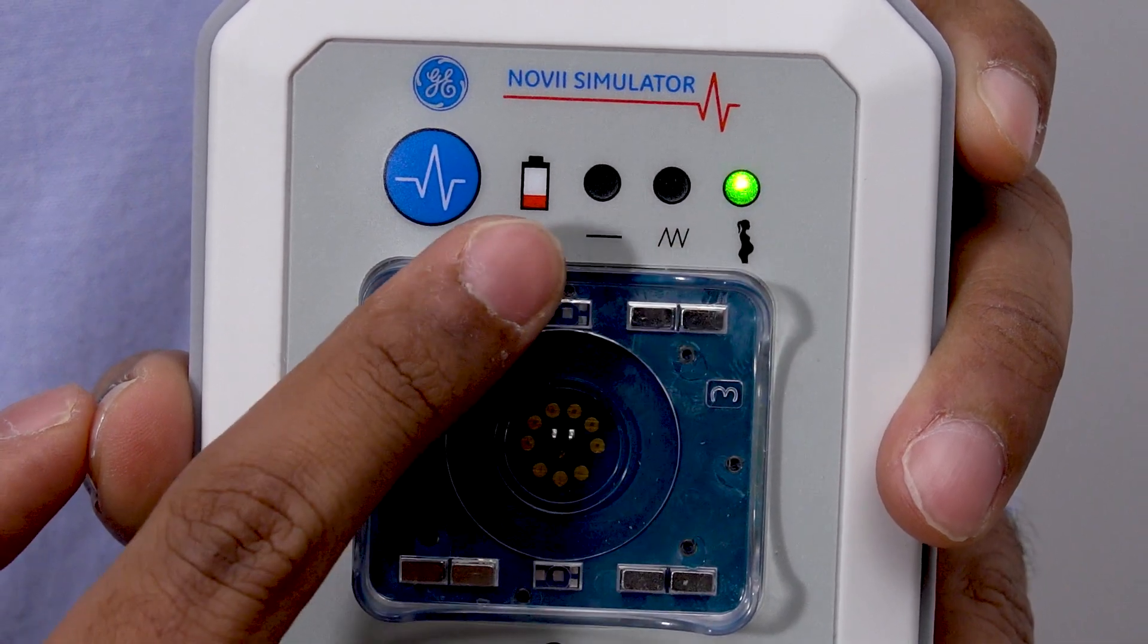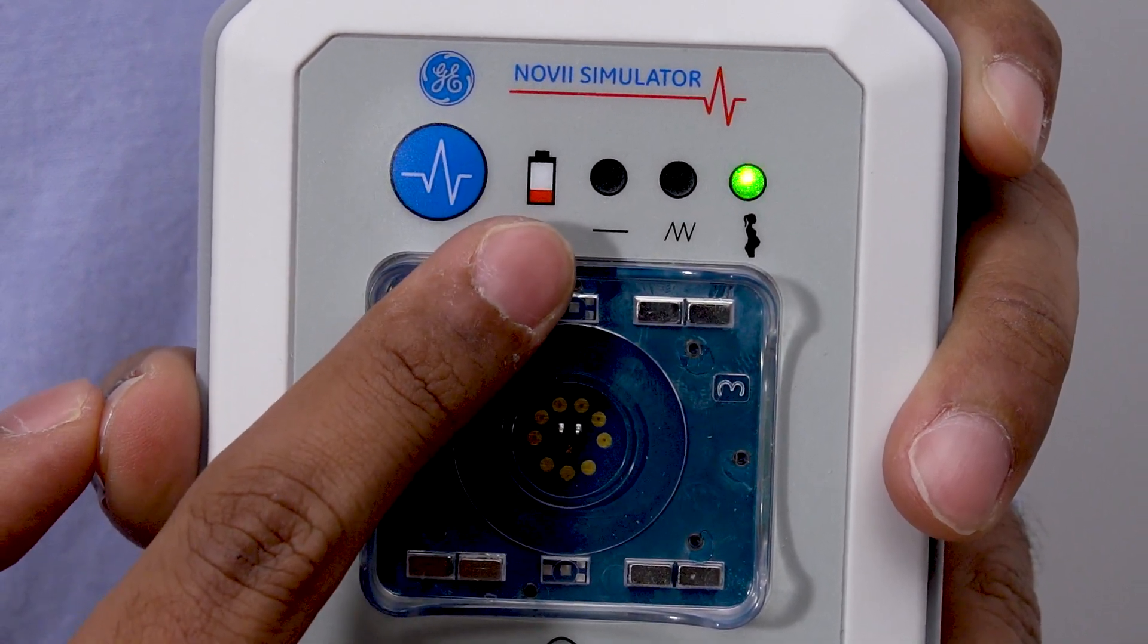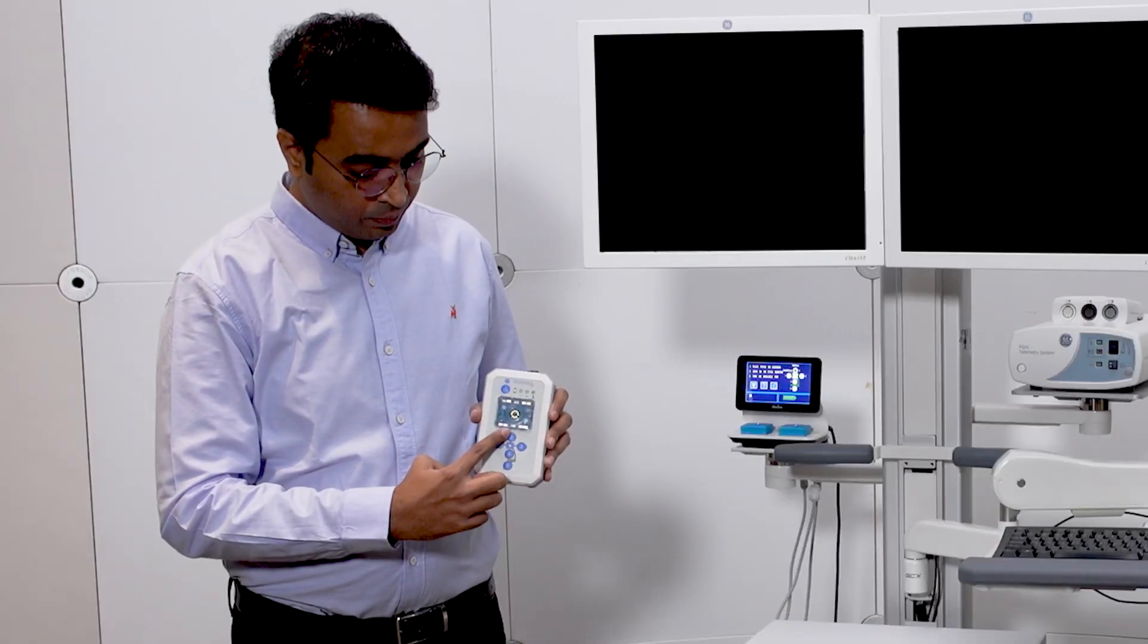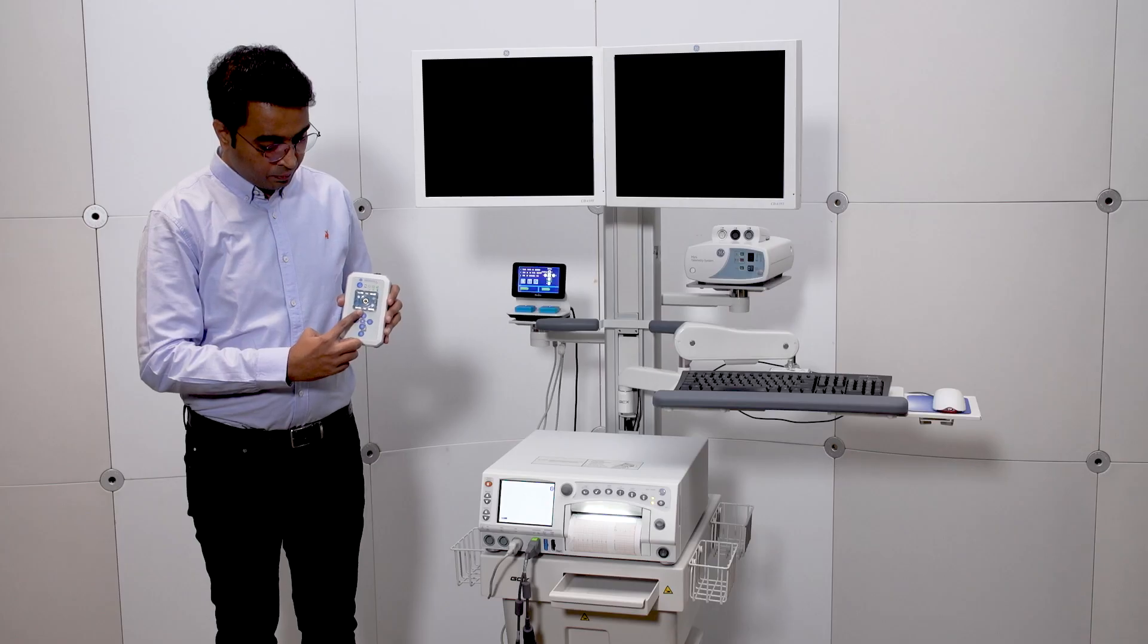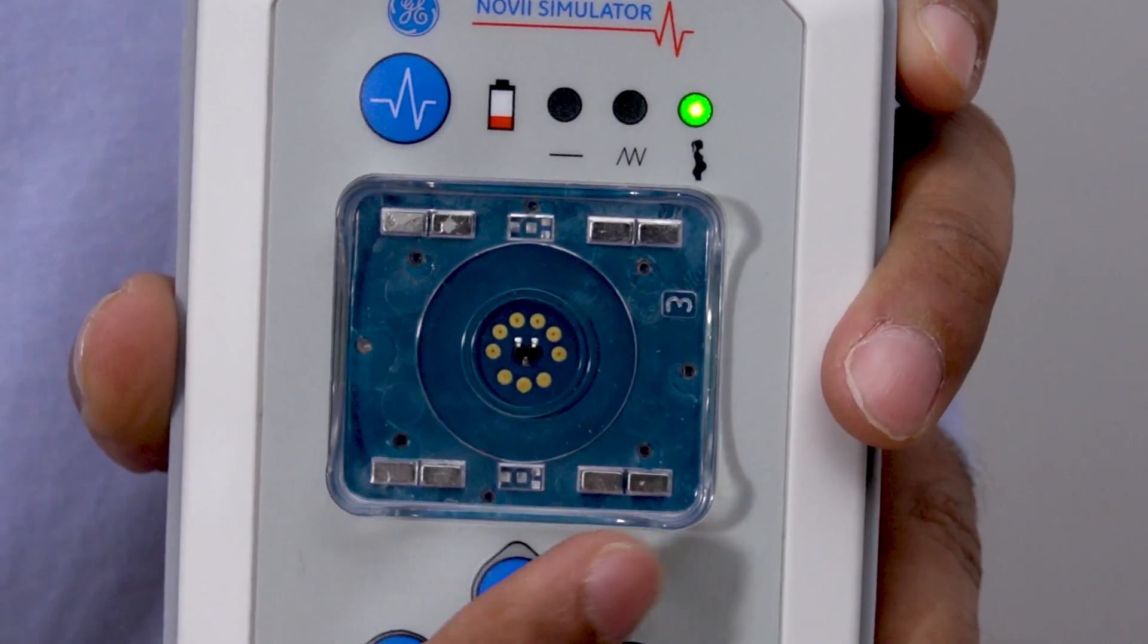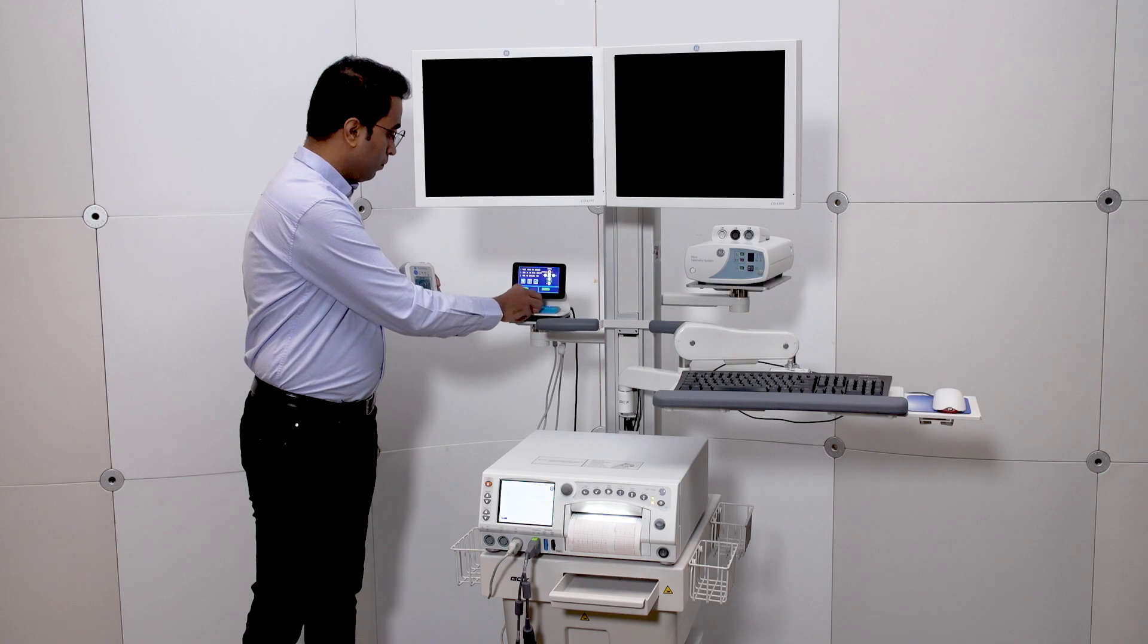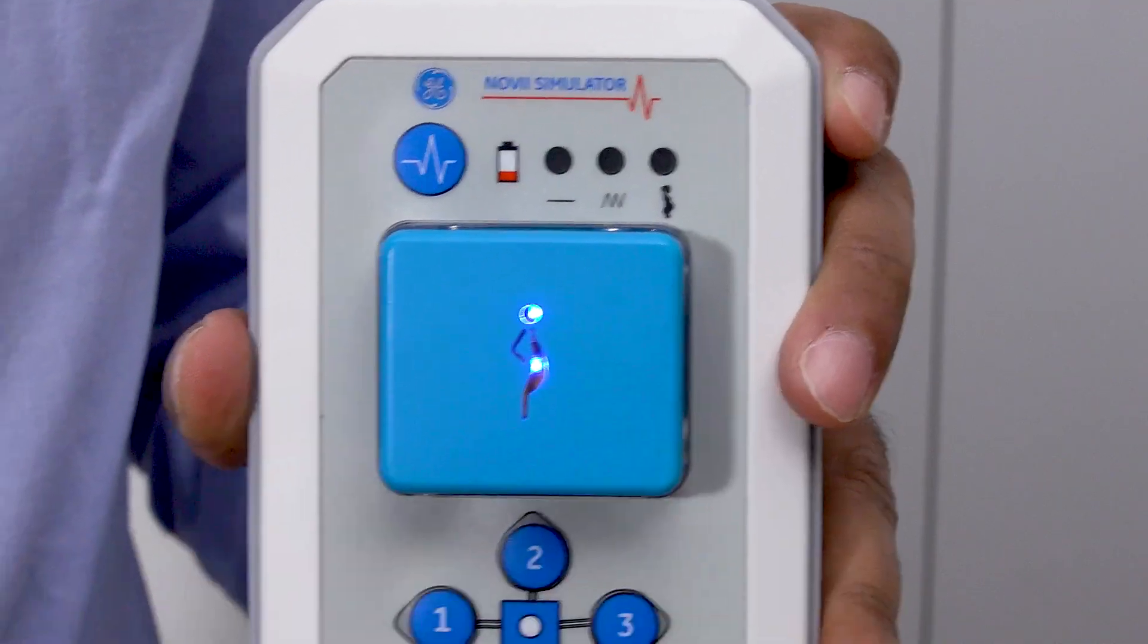Next to the mode selection button is a low battery indicator, which will flash to indicate that the battery is critically low. This is the Novi simulator pod clip. It magnetically holds the Novi pod in the correct position. Do not use it with any other pod. The pod fits into the clip, like this.